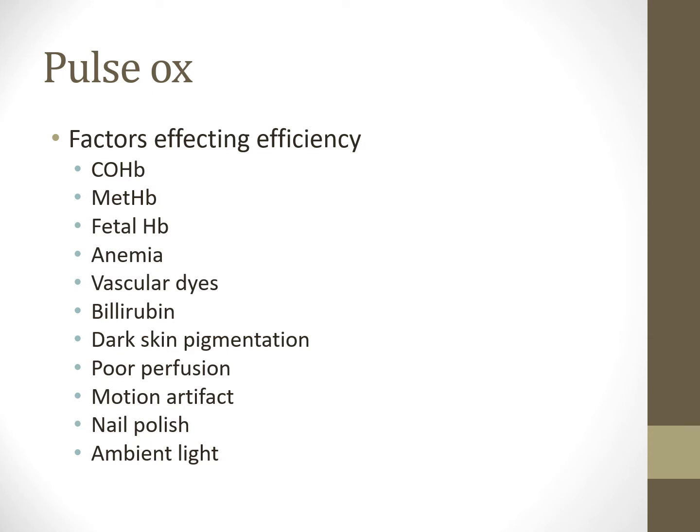Factors that affect the accuracy. Look at all this, right? So here's the big thing. You see, everything here can easily cause an issue. So carboxyhemoglobin, methemoglobin, fetal hemoglobin, HbF, upstairs in the NICU, right? So that's why we're okay with running different saturations up there.